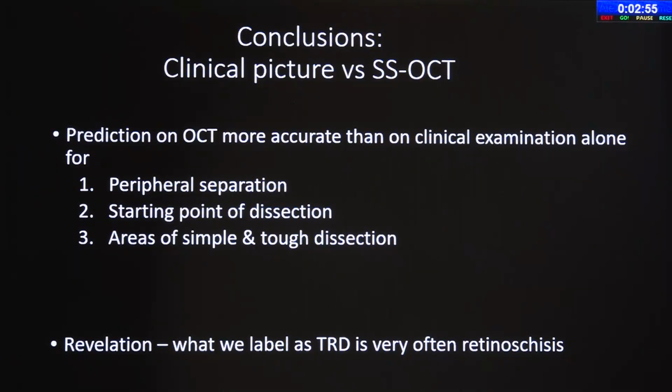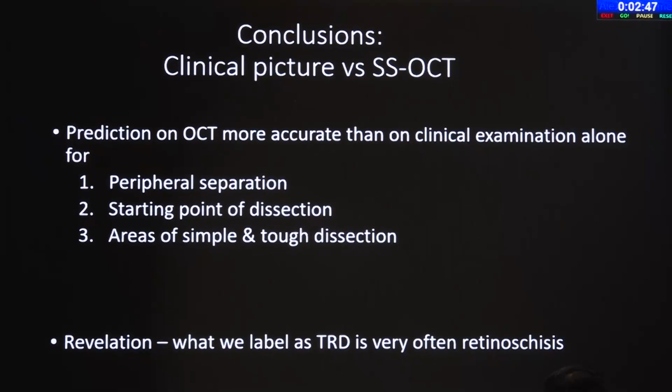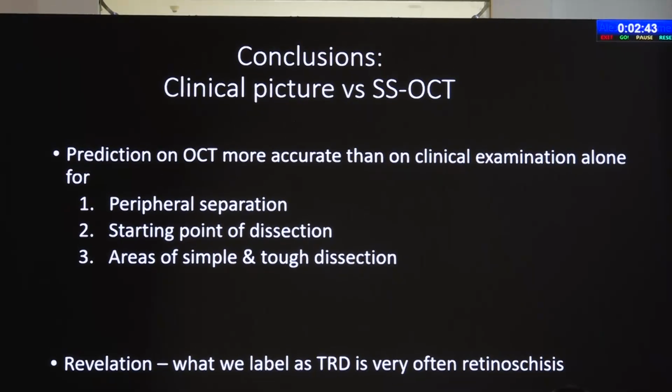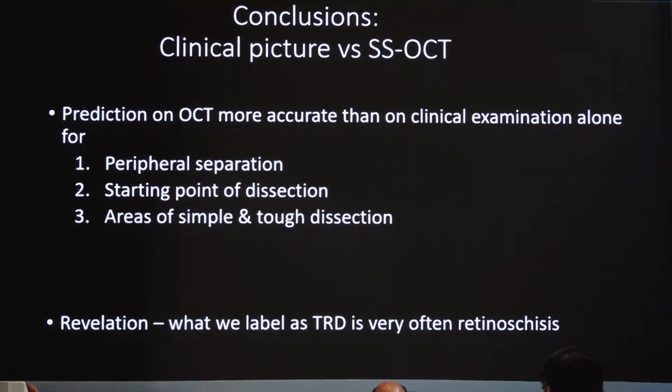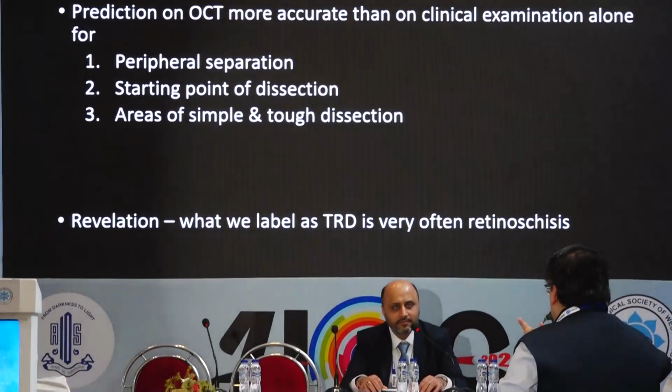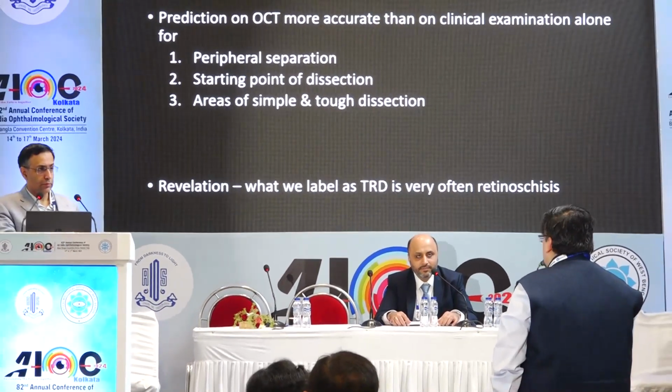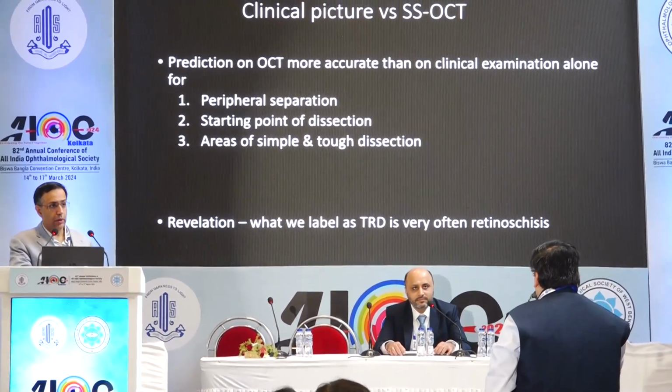Yeah. Dr. Ritesh. Since you mentioned intraoperative OCT, we tried to study that in preoperative and intraoperative OCTs where we had good visualization. Most of our pre-op OCTs were able to pick up the findings that we wanted to know. One very useful point was picking up sometimes a hole under a TRD in cases of CRD.